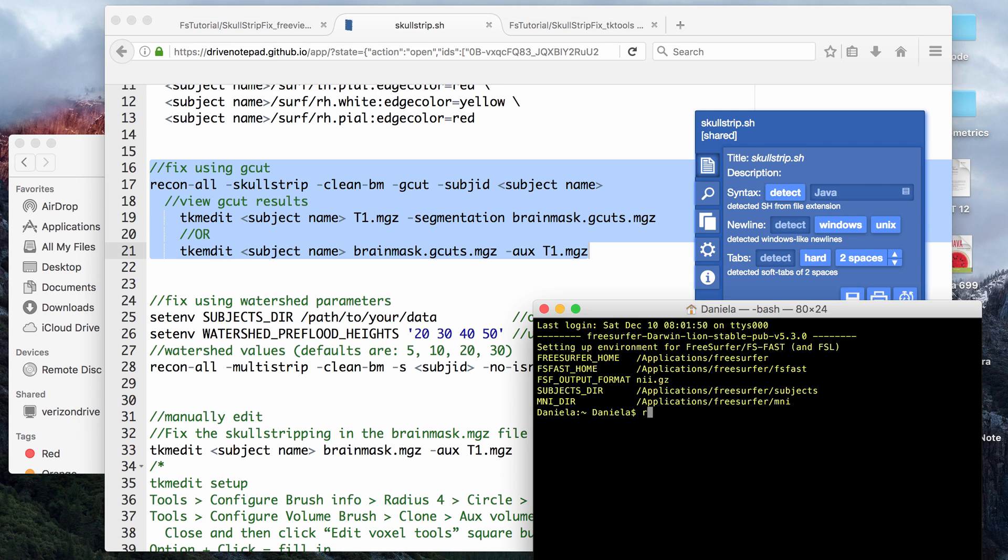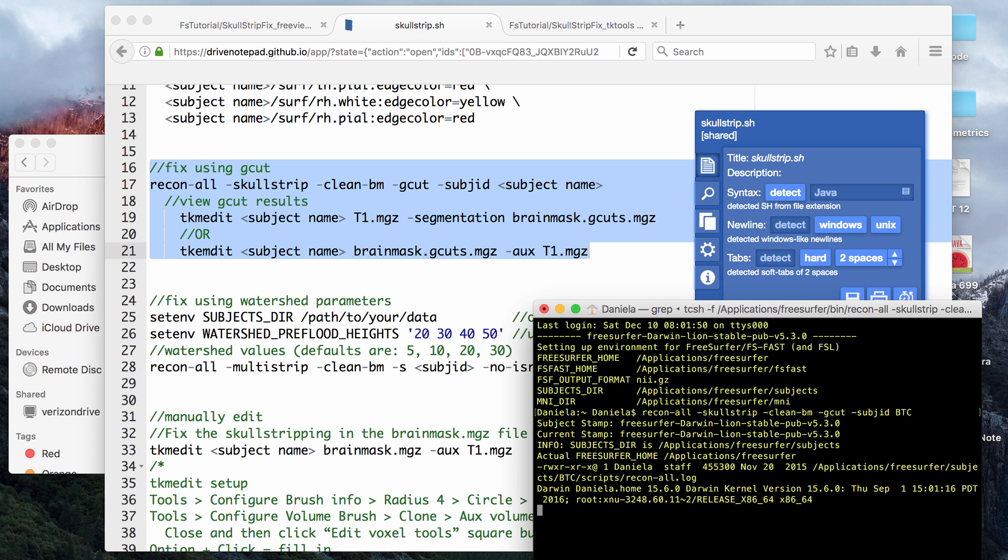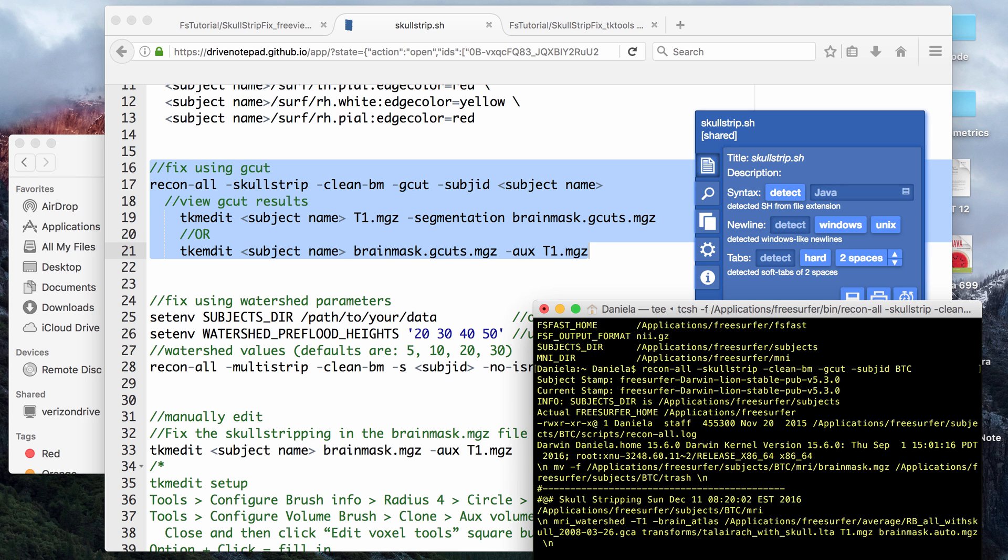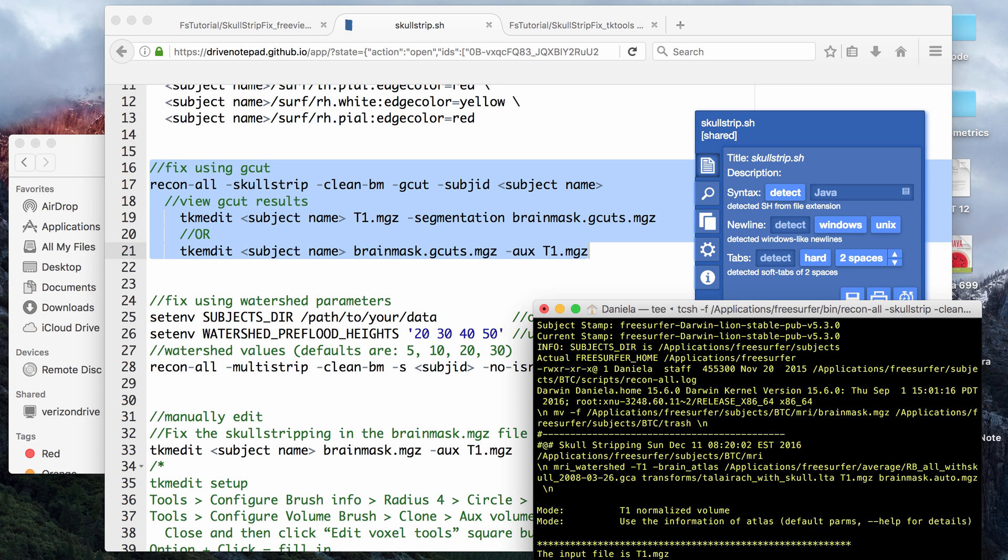I put the fix using gcut code here. Okay, so to use gcut, we type in recon-all -skullstrip -clean-bm -gcut and then the name of the subject ID folder. You click enter and that will run. It shouldn't take too long to run, just maybe a couple of minutes.